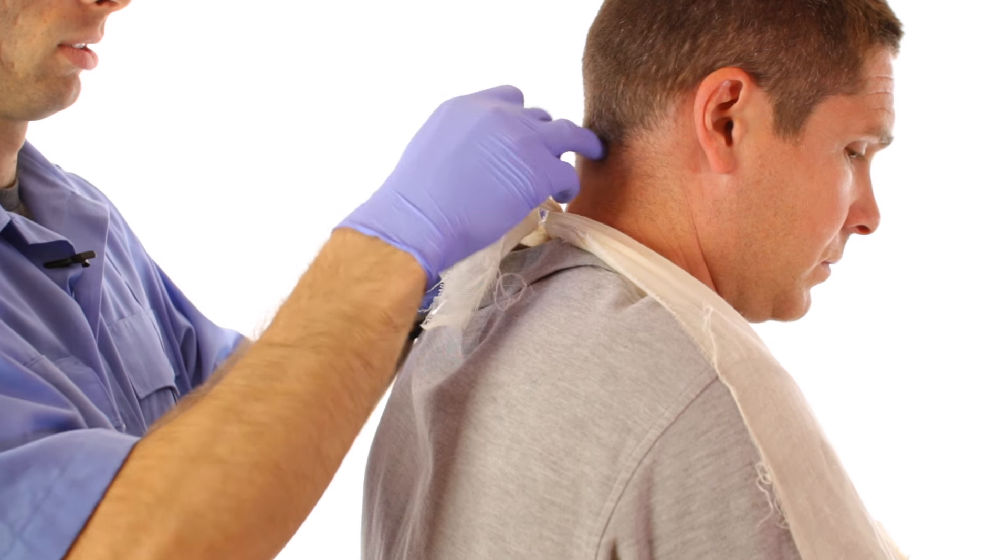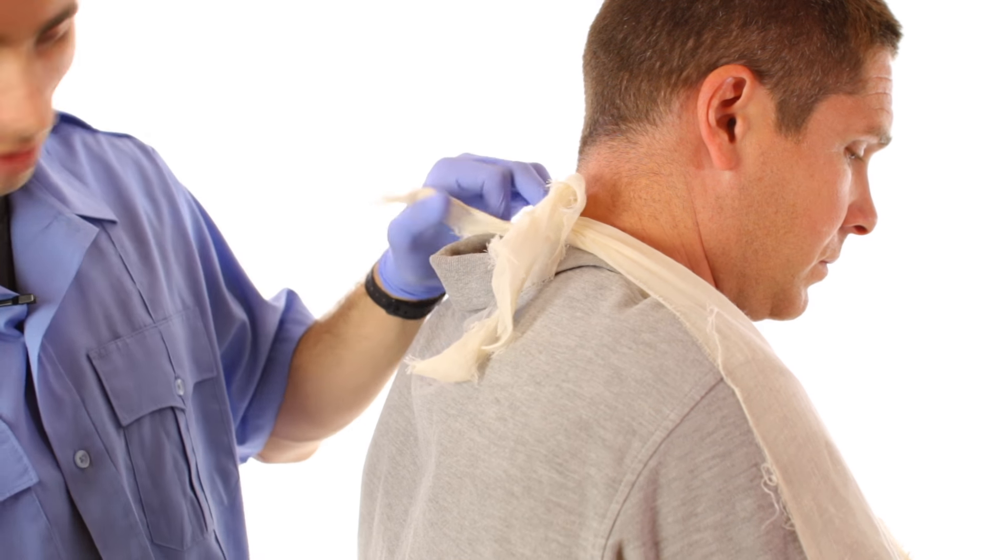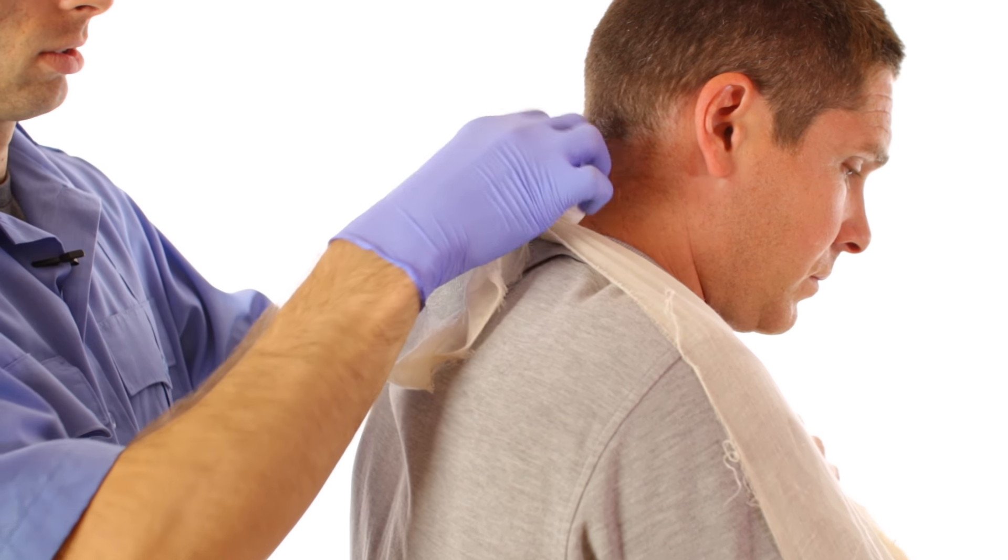Knots against the skin can become very uncomfortable. Be sure to pad between the knot and the skin with some gauze.